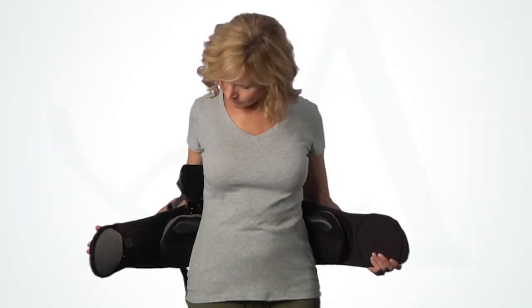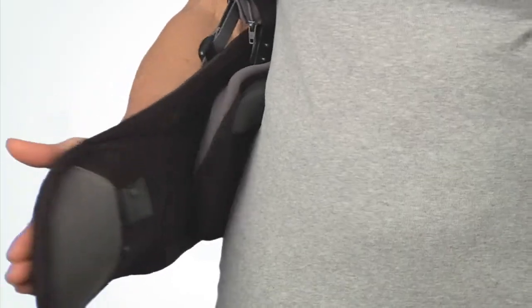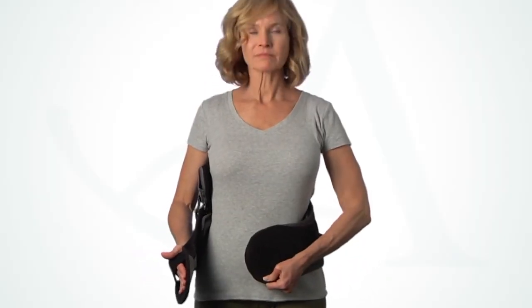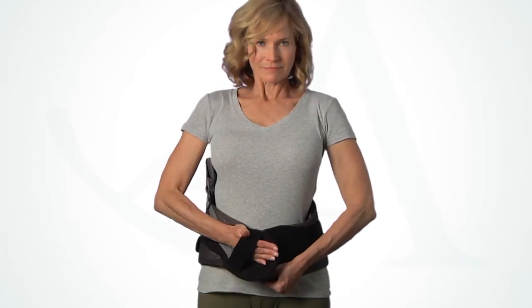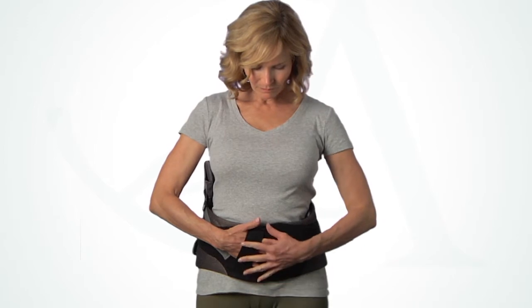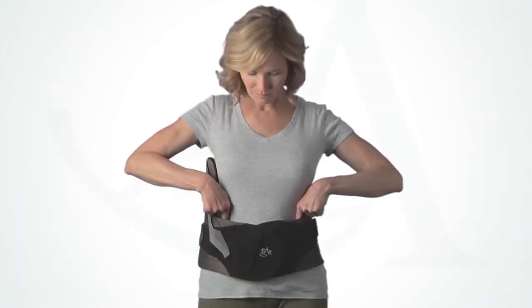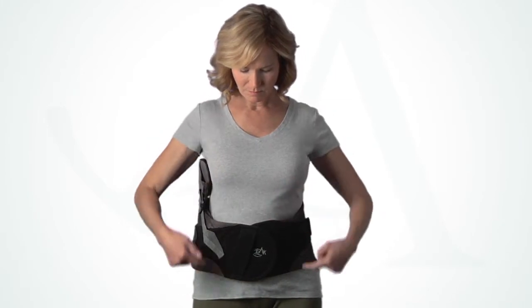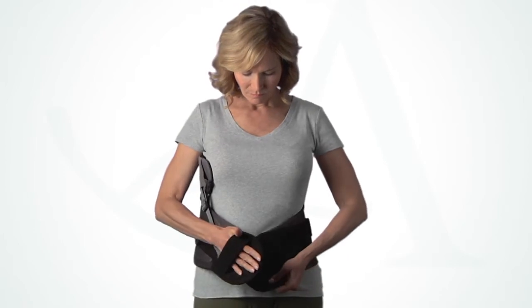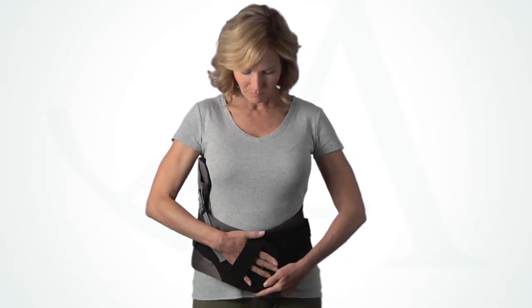Have the patient apply the brace. Ensure that the patient understands the importance of reapplying the brace in the same position each time. Have them inhale deeply and wrap the belt around as tight as possible, pressing down firmly to secure. Before tightening, be sure both the top and bottom of the belt are snug. If needed, angle the ends of the brace to achieve a snug fit at both the top and the bottom.